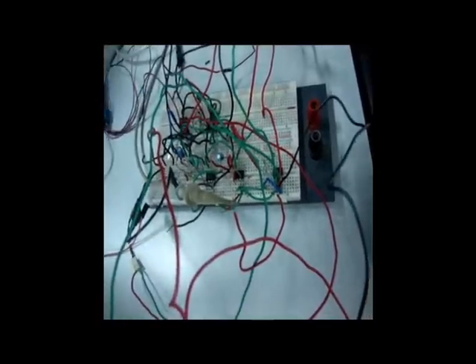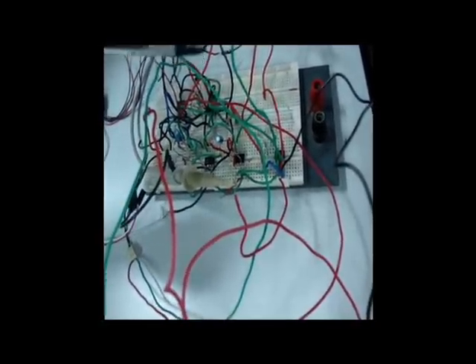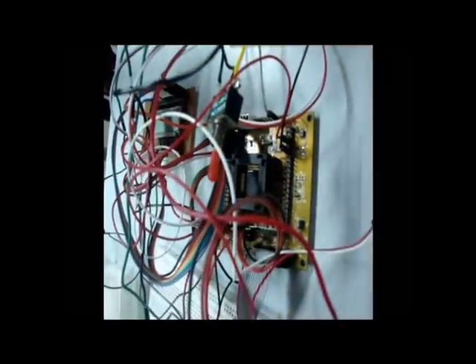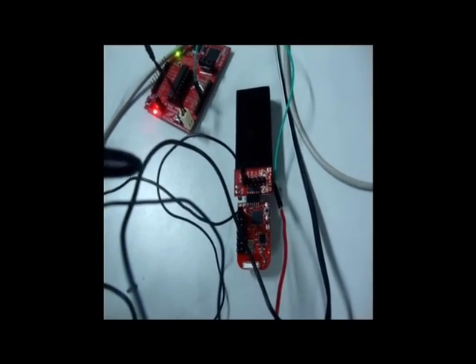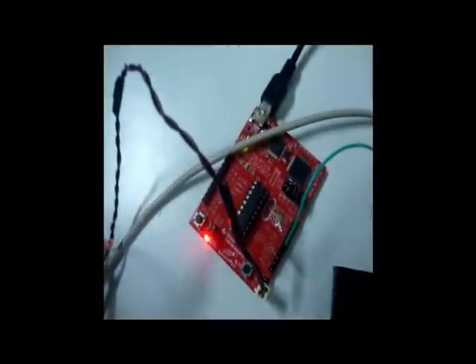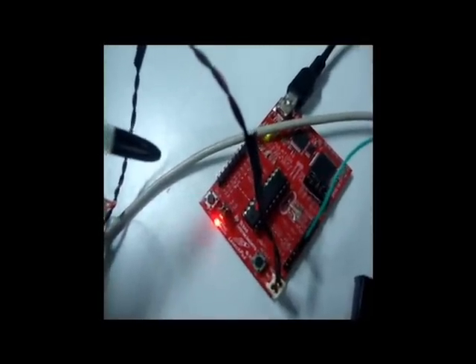The output PPG waveform from the analog front-end module is fed into three microcontrollers. The first one is the MSP430FG439. The second one is the MSP430F2274 on the eZ430-RF2500 target board. And the third one is an MSP430G2553 on the MSP430 LaunchPad.